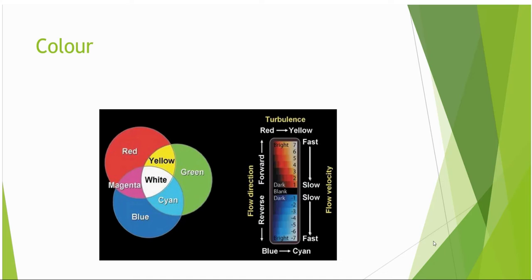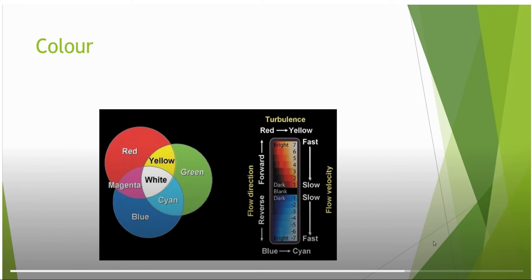Another detail that can be attained in colour Doppler is the variance. A large variance indicates a wide range of Doppler spectral shifts or velocities. This colour map is not always turned on, but has specific use in vascular and cardiac ultrasound, where variance is useful when assessing stenosis or regurgitation.